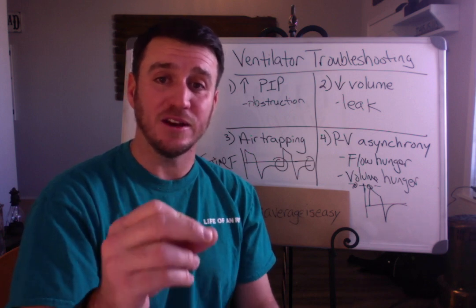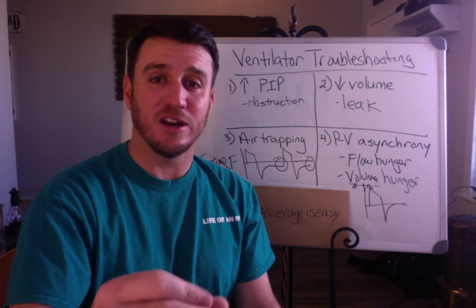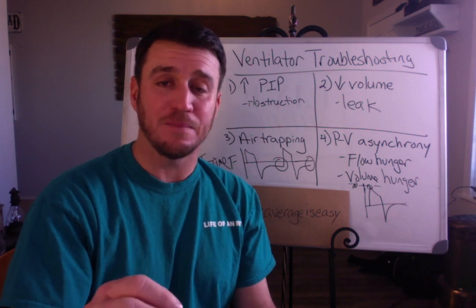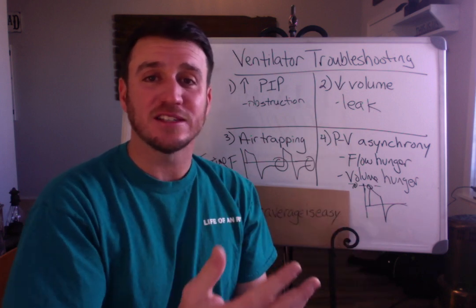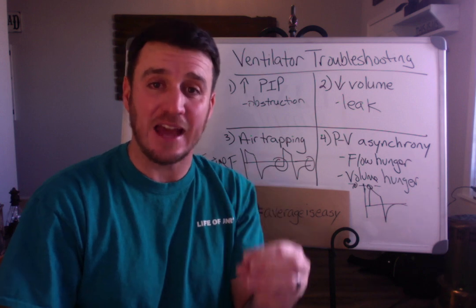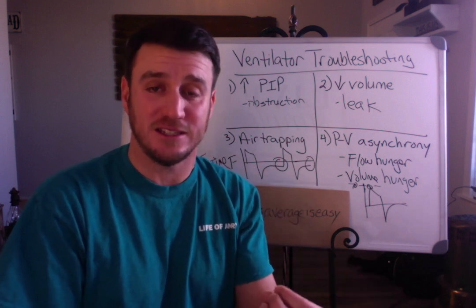If you're meeting their inspiratory flow, see what their tidal volumes are. What are they asking for? What do they want in a tidal volume? And oftentimes you'll find that you have them set on 400 and they're asking for 460. That's what they want to do. That's what they would do if you let them breathe exactly how they want to. They would be taking tidal volumes of 460.